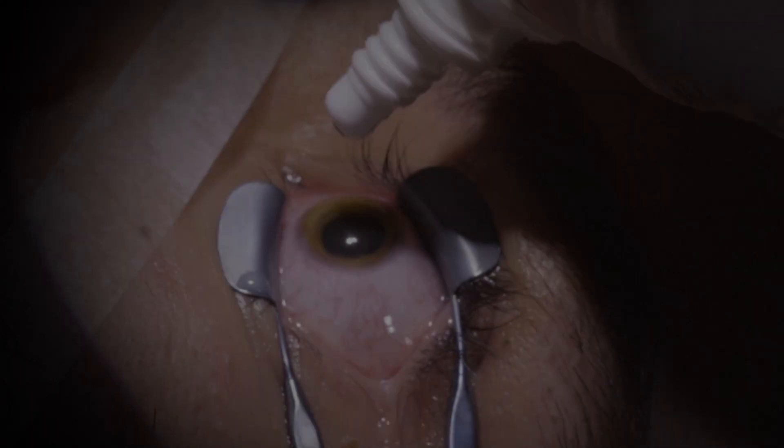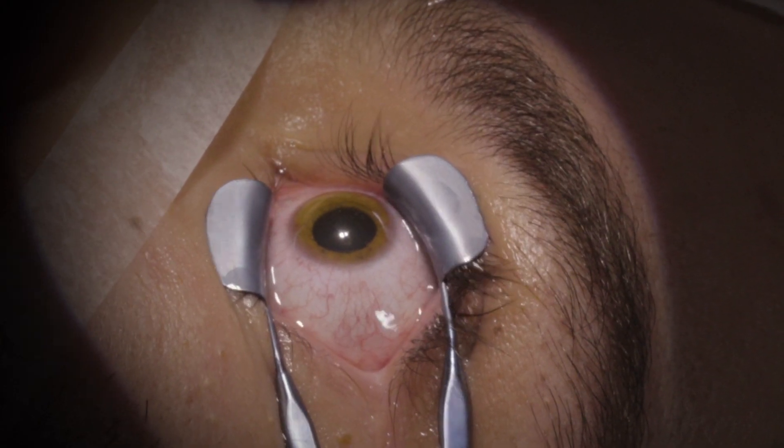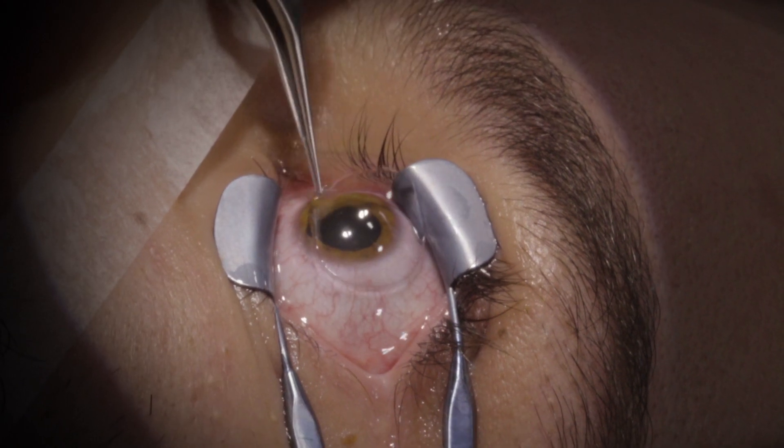Now we medicate the surface, then we put a soft therapeutic contact lens that will be removed later. Let's go ahead.